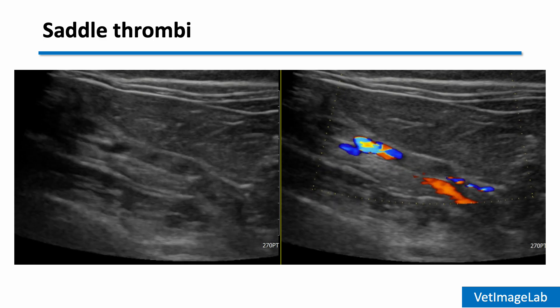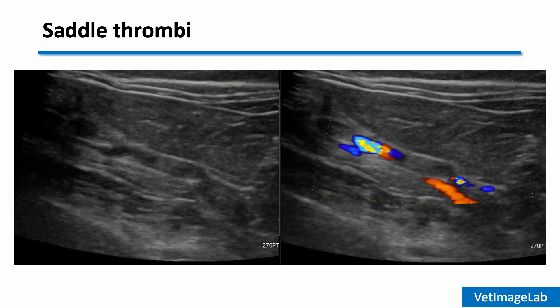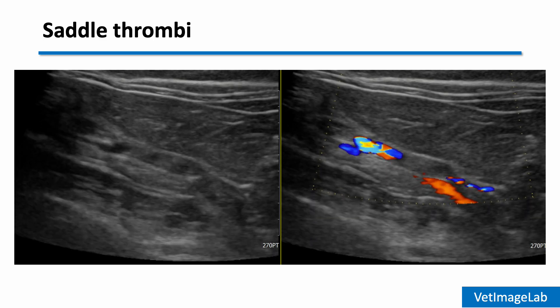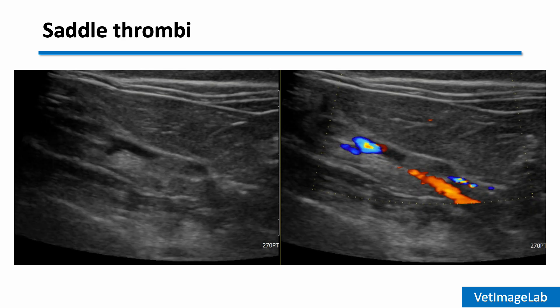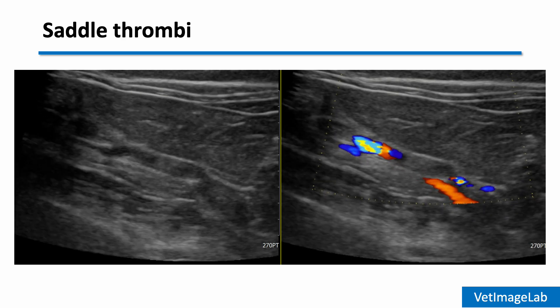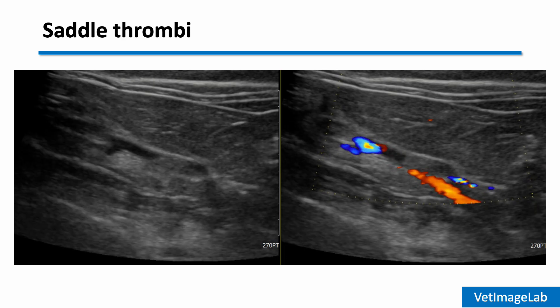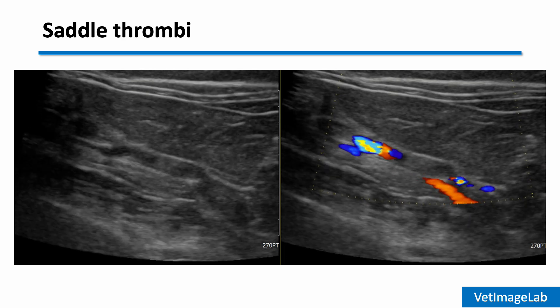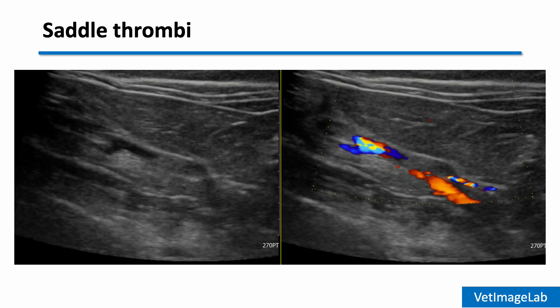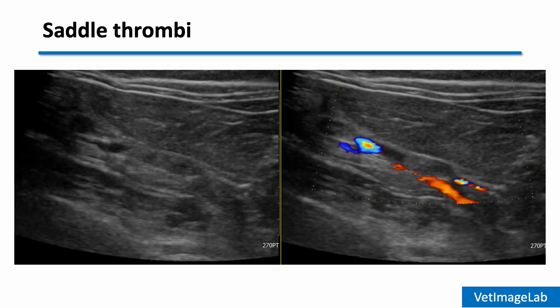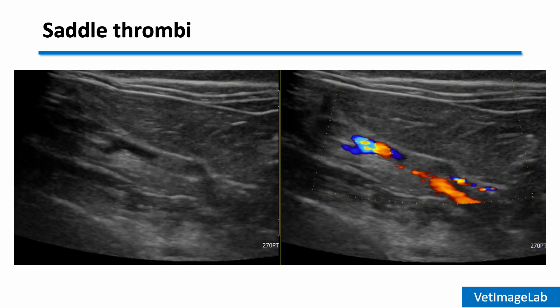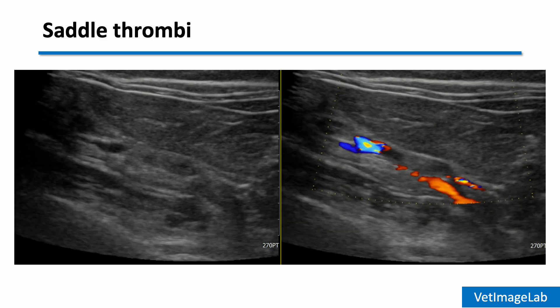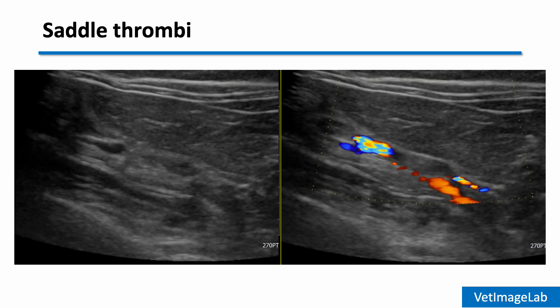Let's take a look at the terminal aorta in a cat with suspected thromboembolism. On the left, a thrombus appears as a hyperechoic structure within the vessel lumen at the aortic bifurcation, right where the aorta splits into the external iliac arteries. On the right, the color Doppler shows a filling defect — a clear absence of color flow at the site of the thrombus. This combination of direct thrombus visualization and abnormal Doppler flow is highly suggestive of a saddle thrombus, one of the most serious complications of advanced HCM in cats.